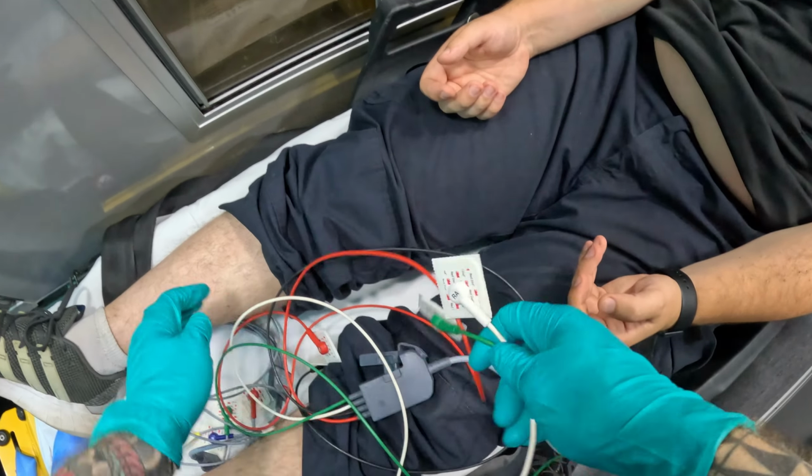I would like to do a cardiogram. It's important that you remain still. And you want to keep them comfortable, maybe put a pillow, right? Make sure their legs are nice and comfortable.